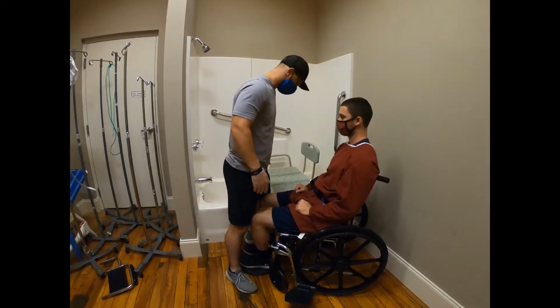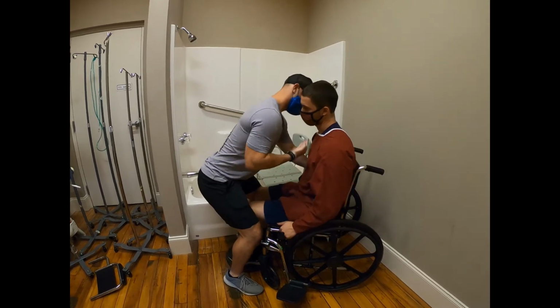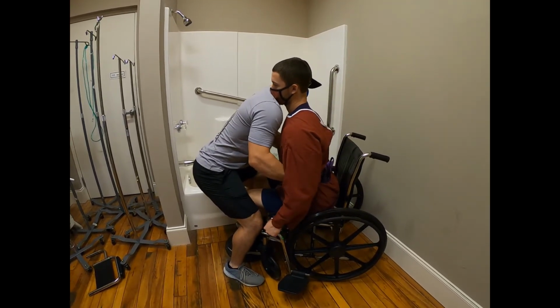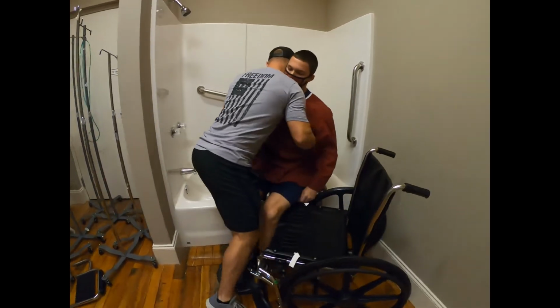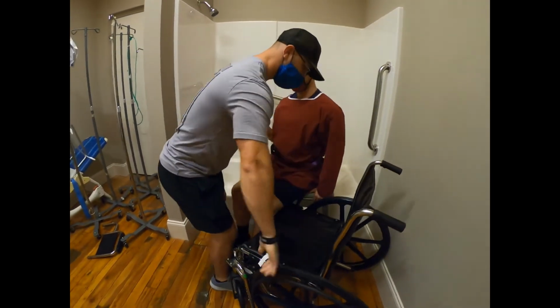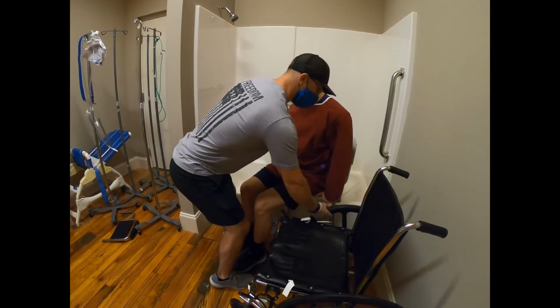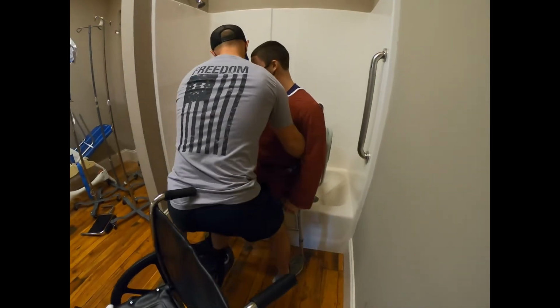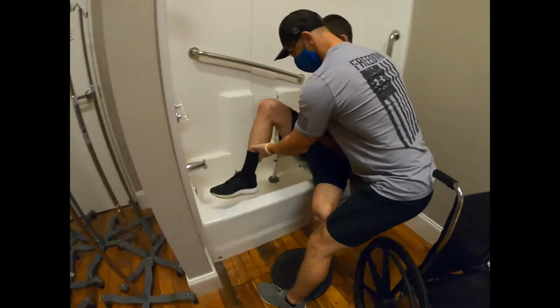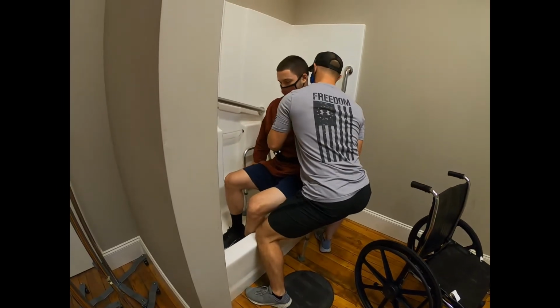Position the wheelchair so it is next to the tub at a slight angle as shown and lock the brakes. Place both of your loved one's feet on the pivot disc and remove the leg and arm rest closest to the tub. Have your loved one lean forward into your shoulder, grab a hold of the gait belt and assist them off the wheelchair and onto the tub platform. Their feet should swivel on the pivot disc as you move them. Have your loved one hold onto the platform as you assist in lifting their legs into the tub one at a time.